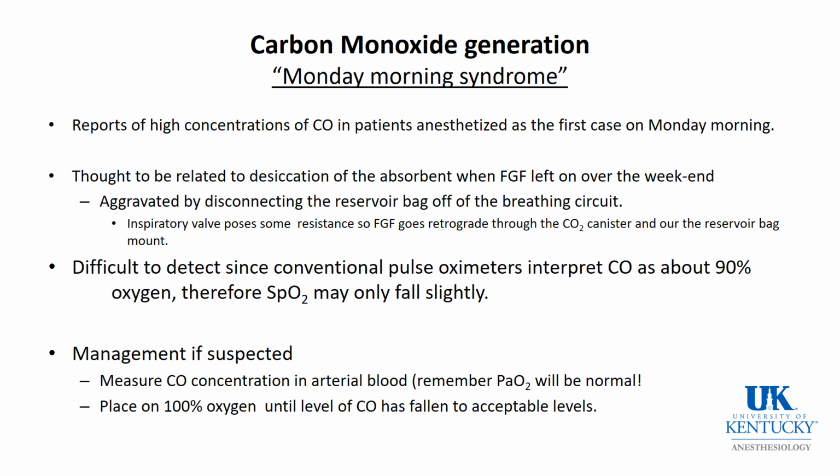And so that was a real problem. Now the techs are very careful about making sure the machines have no fresh gas flow. However, if you come in the morning and you see the fresh gas flow is still on and you plan to use desflurane, I recommend that you have them change the CO2 canister.